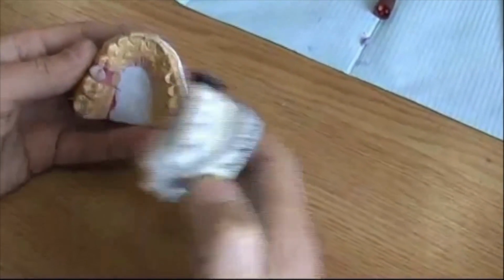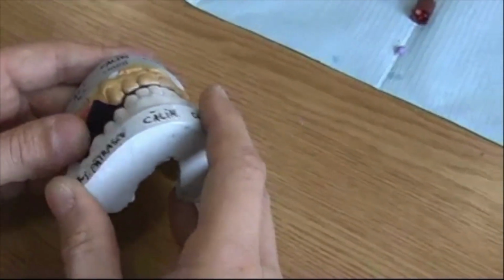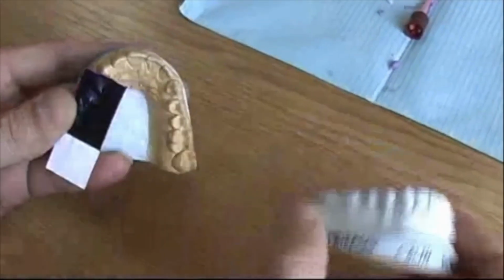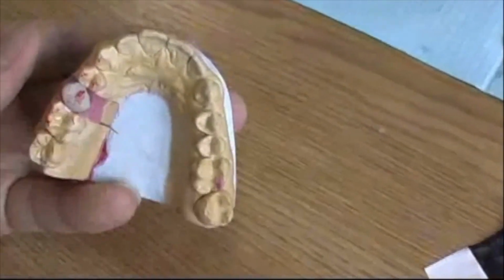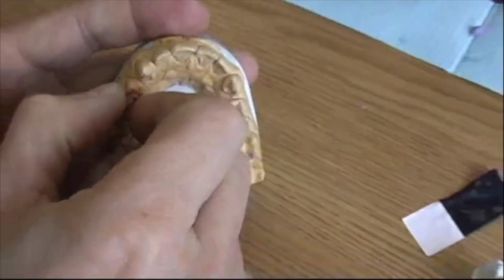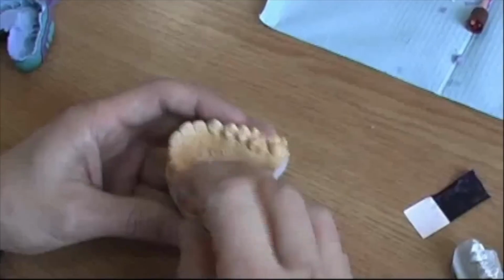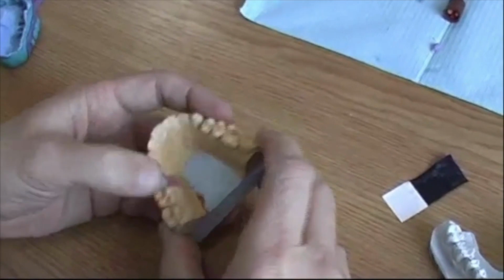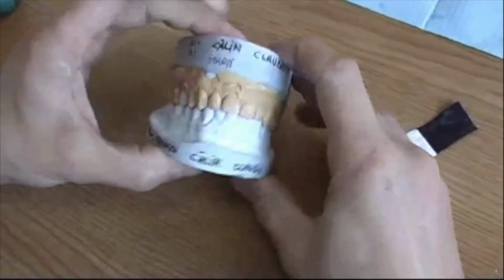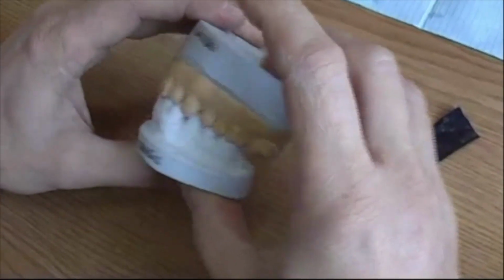You see the points, and now there you have to bring the micromotor and the burrs. But we don't do this like this on the model. Again, we pretend here to be in the mouth of the patient, so we ask the patient to bite slowly, slowly, not too strong in order to avoid breaking our crown. It's a plastic after all. And then once you're done and you trimmed everything and you see that you're okay in the occlusion, then you temporary cement it and you send the patient home. Patient happy.